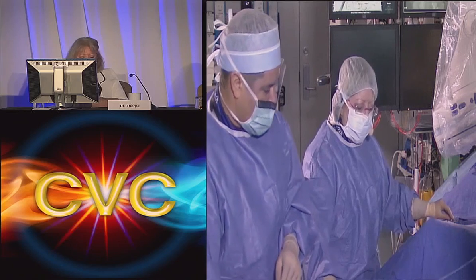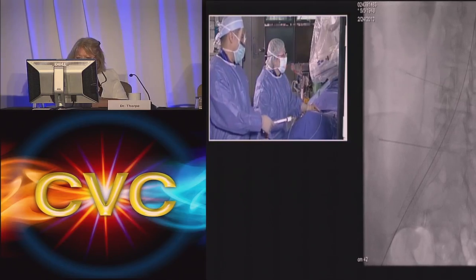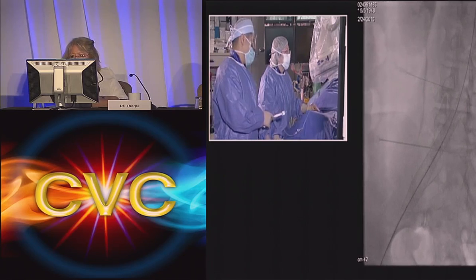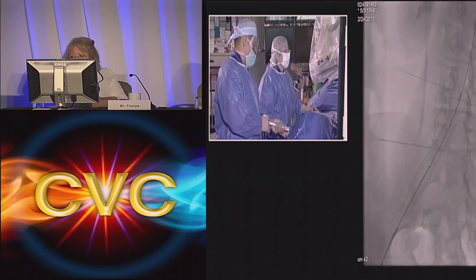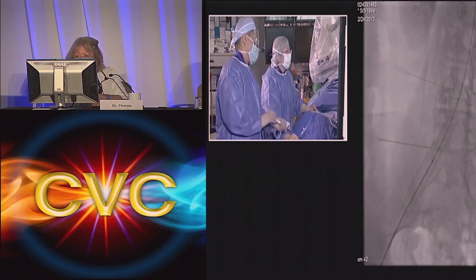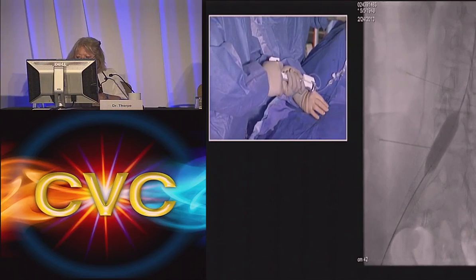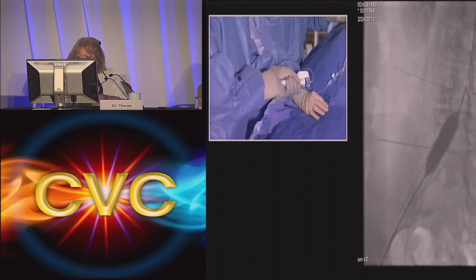Okay. We'll go live, please. I'm going to go right to that common iliac lesion. Carefully into that area that's tightest right there. Okay, go ahead and inflate the balloon, please. It'll foreshorten slightly when we do this, but we have margin for that. Go up to 4. Good, okay. Okay, now come down slightly. Just go ahead and deflate.